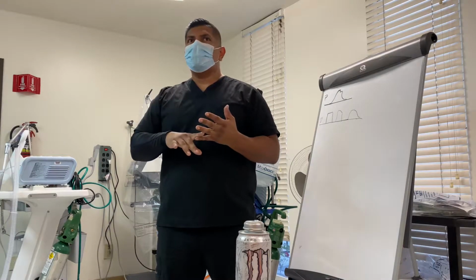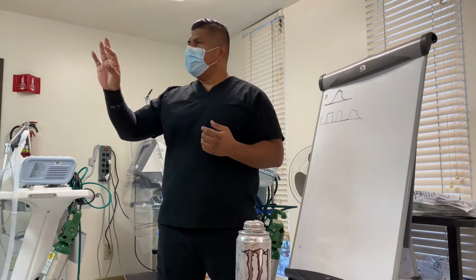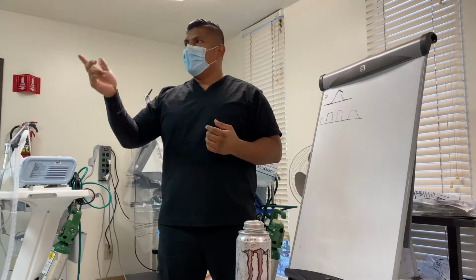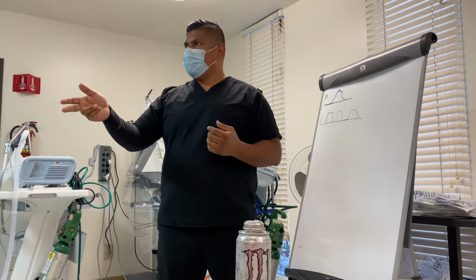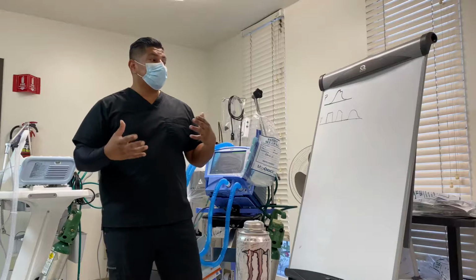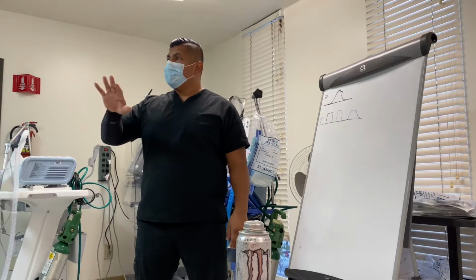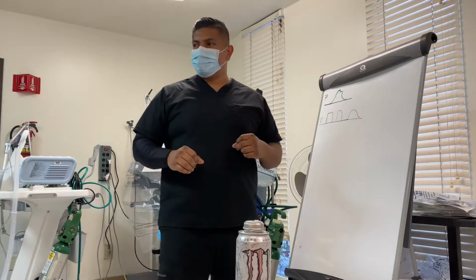First and foremost, here you only use 3 major vent modes, right? It's volume AC, volume SIMV, pressure support ventilation, and maybe PRVC, or starting to toy with PRVC. We'll go over some of those as well. And no APRV, right? Not yet. Okay, cool. That's a great start.